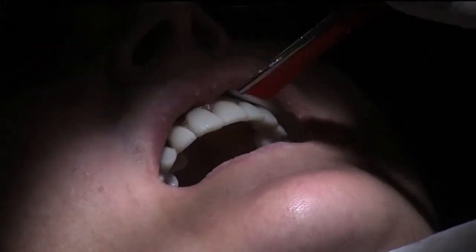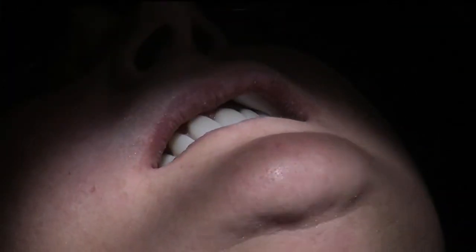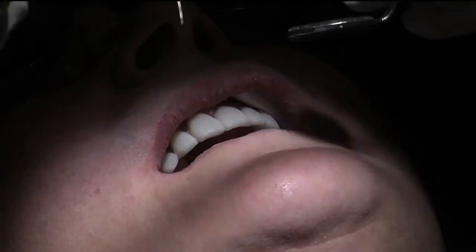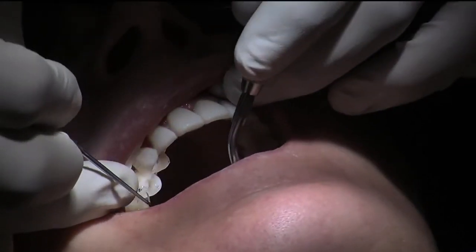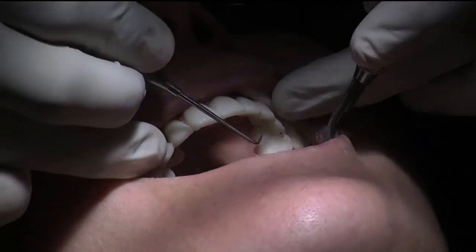Then I switch and just dry the teeth slightly. I'm going to use the red paper now — tap up and down — which is a lot thinner. Tap this side again. What this does is it makes a mark: there's a blue mark and then a tiny red mark in the middle.